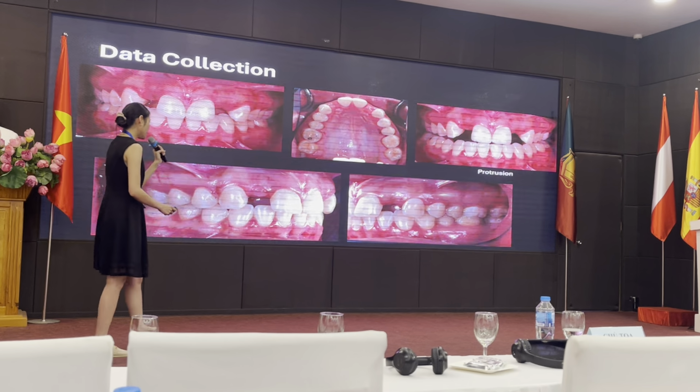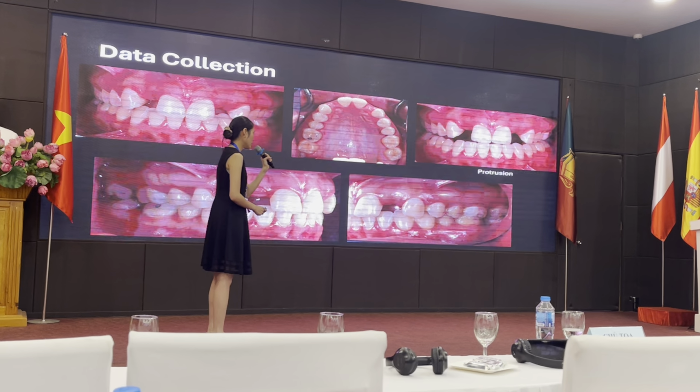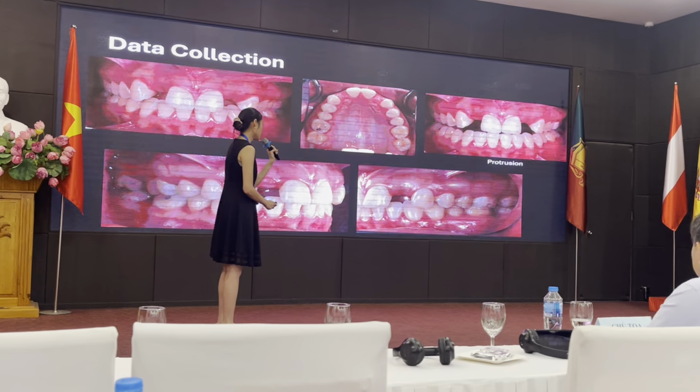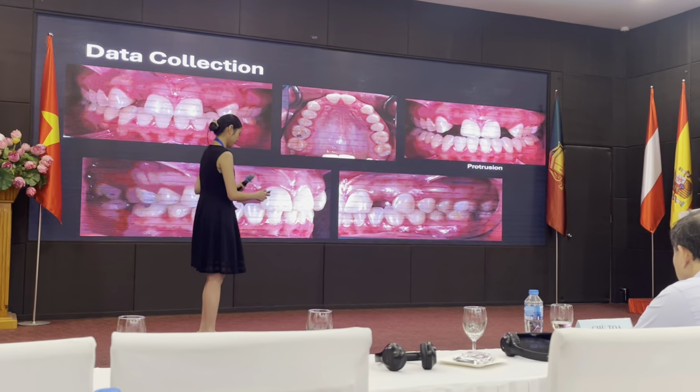And another important thing is about protrusion, because anterior teeth are inclined. So you don't want to apply too much excess loading on your teeth. So you want to check the guidance and to see where your future incisal edge is going to be.